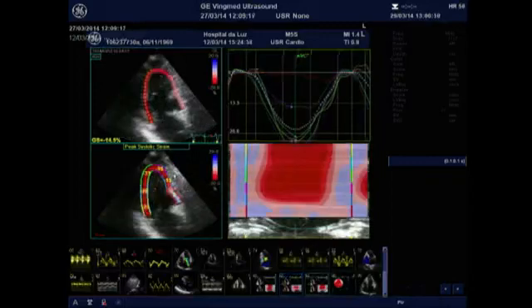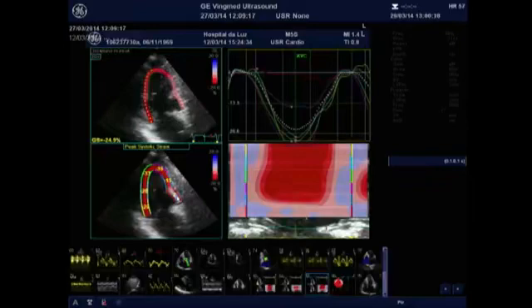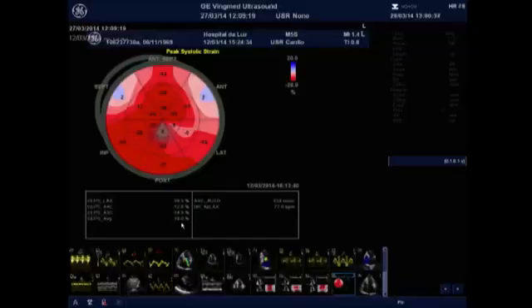And in the 2-chamber view, again in the anterior wall where the ASA procedure was performed, there is a very low -2 regional longitudinal strain, and the other segments are okay. Overall, the global longitudinal strain in this patient is okay because most of the segments have preserved regional longitudinal strain, and here you can clearly see the area where the ASA procedure was done.